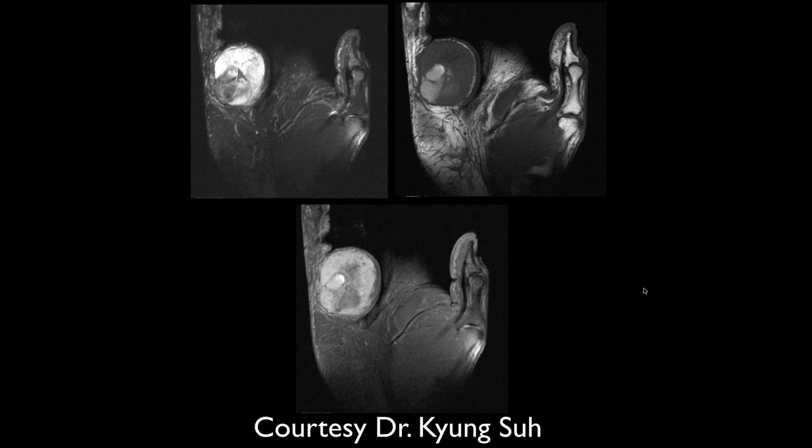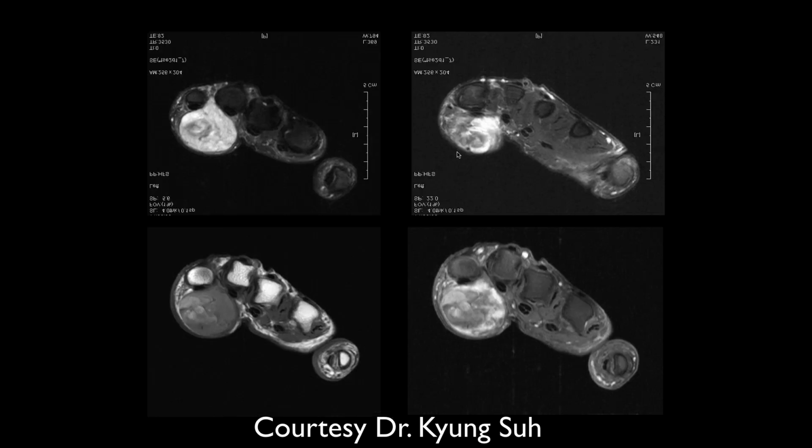And then we have the STIR image, T1, and maybe a post-contrast fat-suppressed image here. So it looks like we have some heterogeneous signal within this pretty well-demarcated lesion in the soft tissues. This is predominantly T2 hyperintense and T1 hypointense with maybe some internal septations within it. And this looks like it's not really fat suppressed, like I said, it's enhancing.